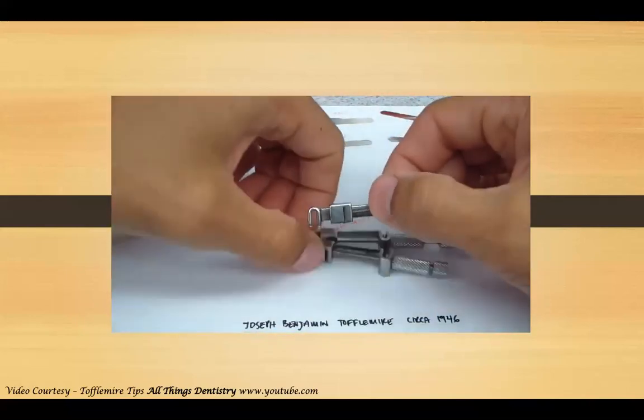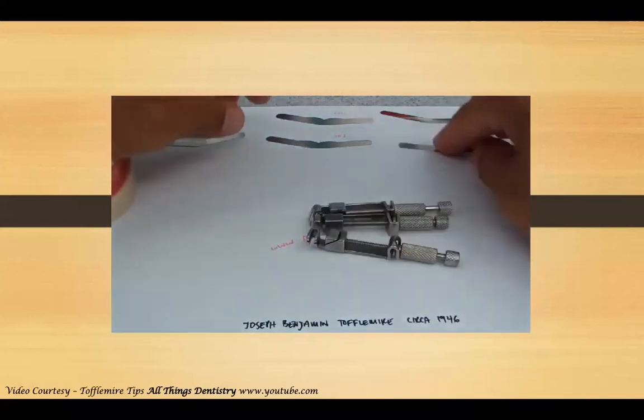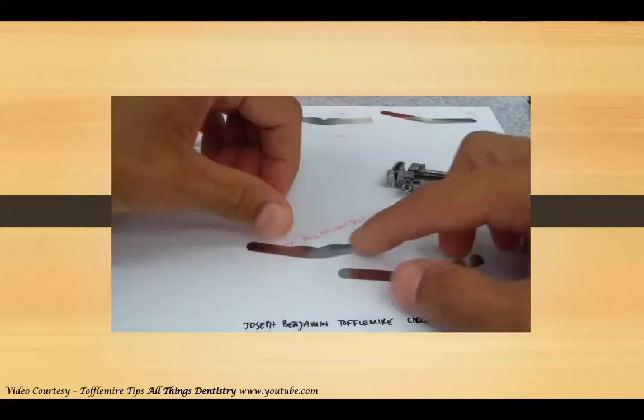Is that there are a number of different bands available. We've got classically the number 1 band and the number 2 band, or the MOD band.